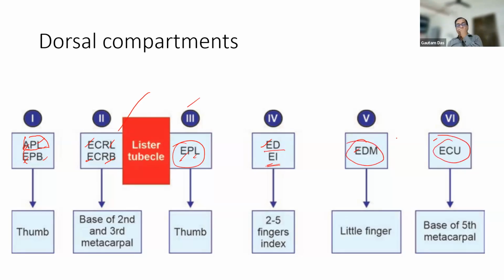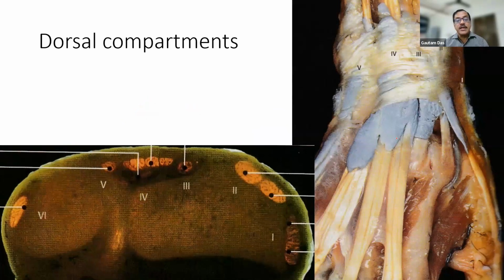These are the compartments, and we'll be able to trace each of them, and we also have to look for the proximal and the distal intersection areas. So this is the MRI, where you can also see similar things. So here is your Lister's tubercle, this projection.